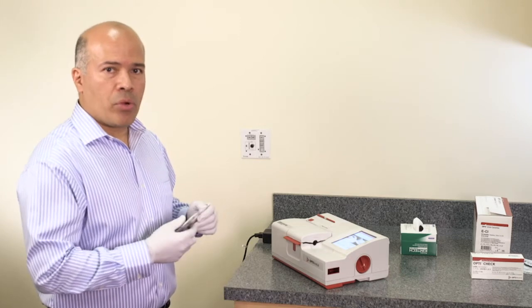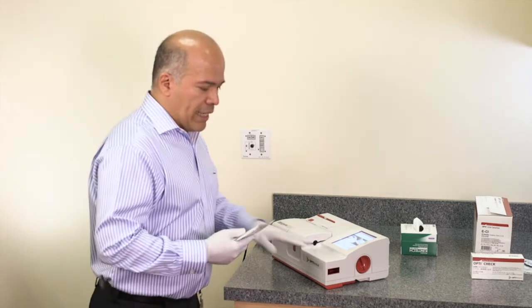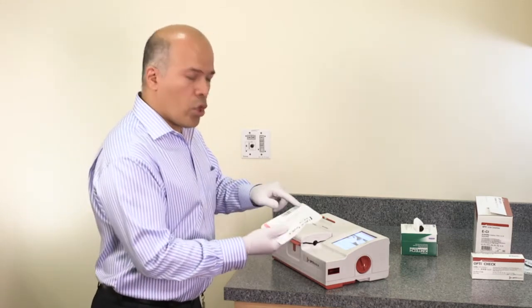To measure a patient's sample, scan the cassette barcode on the barcode reader. The light of the barcode reader has to cover the whole barcode.